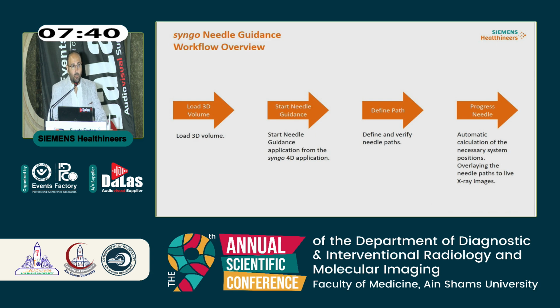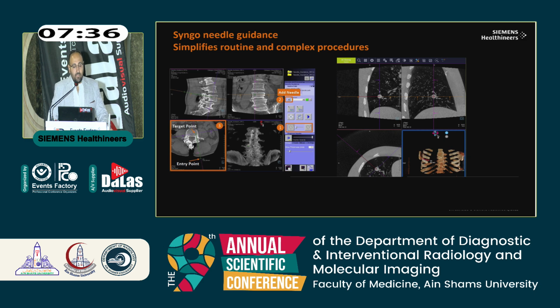And the system will do the rest of the work. Here we can do our DynaCT or CT, so we can precisely detect our lesion, and the physician is going to mark the target point and draw a path from the target point to the entry point.